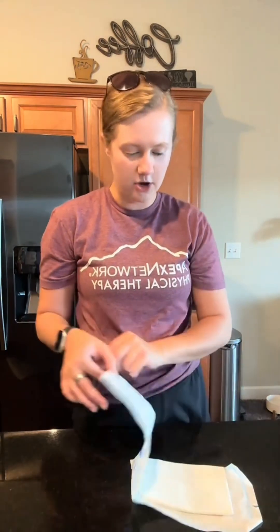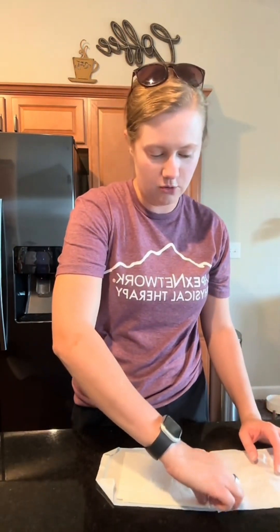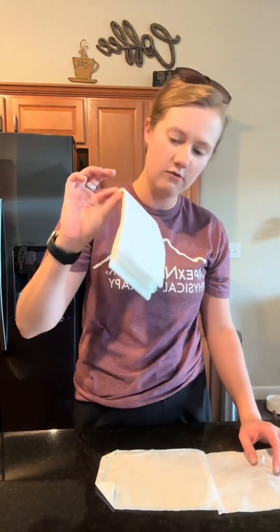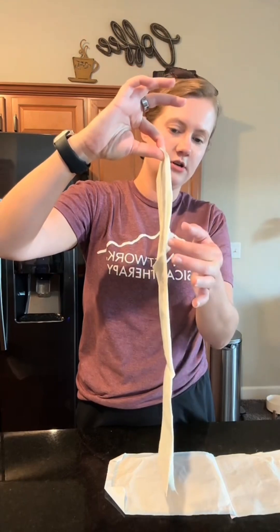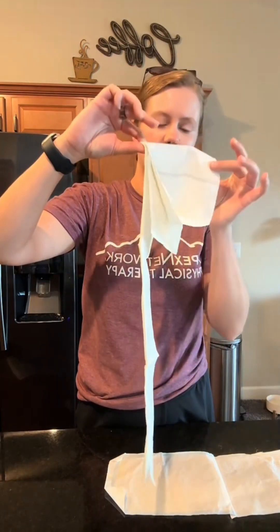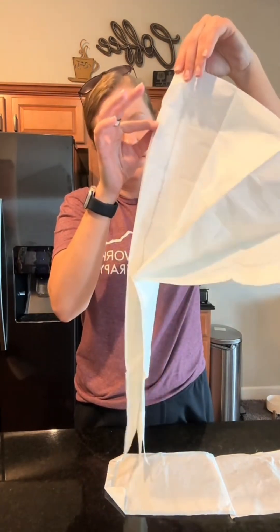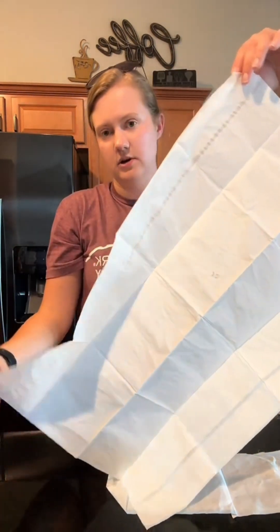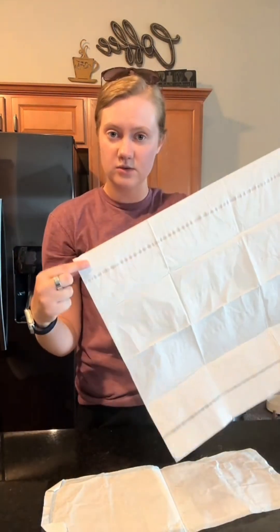This is my sterile drape package. I'm going to open it up — you have a one-inch border that you can grab it on. It's actually upside down so I'm going to turn this package around and grab the corner of it, all folded together, at that one inch. Then we're going to let it fall — we don't want it to touch anything. Then we're going to grab one corner here and open it up like so.